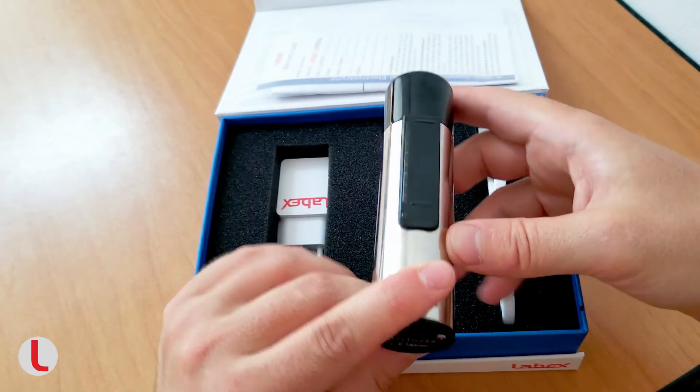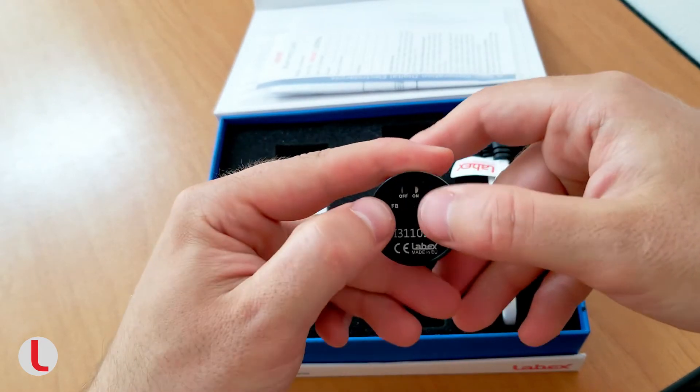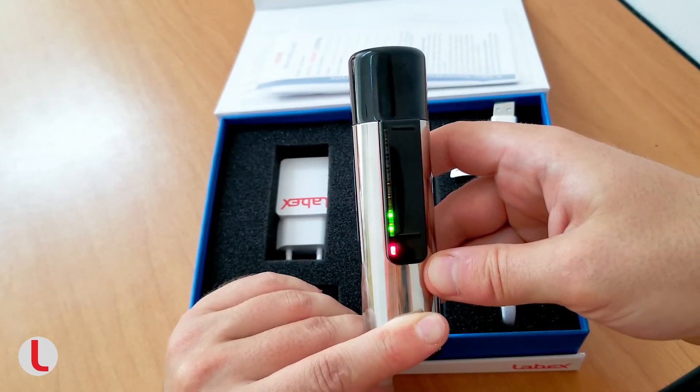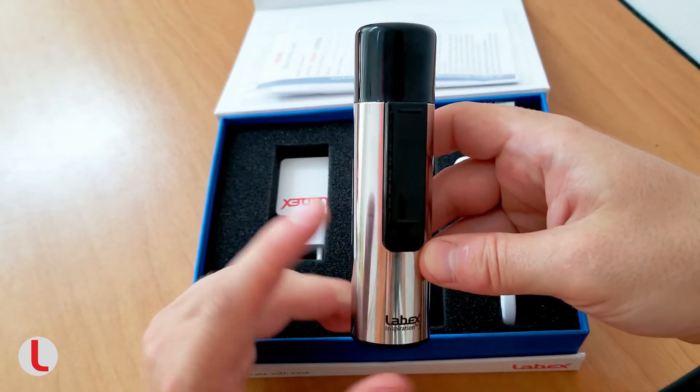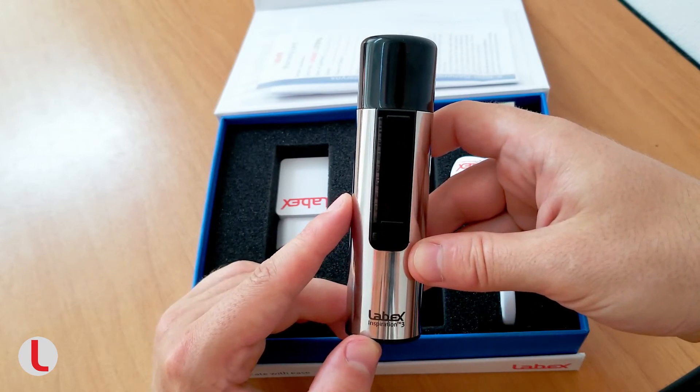Here is an example of how we can select number 2, the Linear Intonation mode. Press the settings button and hold it pressed. While holding the settings button, turn on the device. Release the settings button to enter the second mode. Now we are in the second mode, which is the Linear Intonation mode.